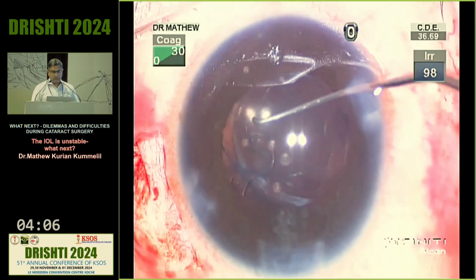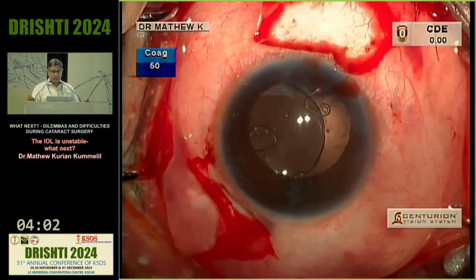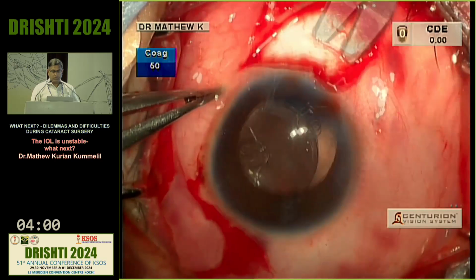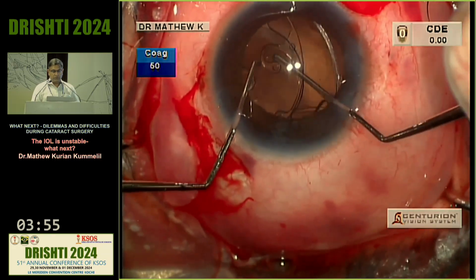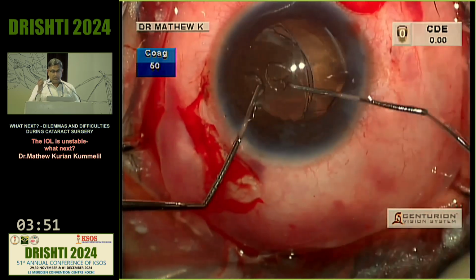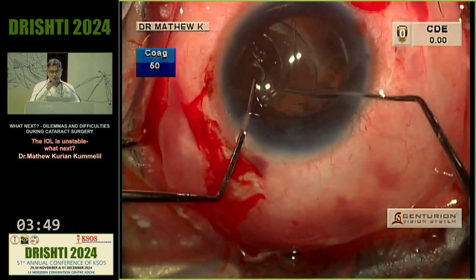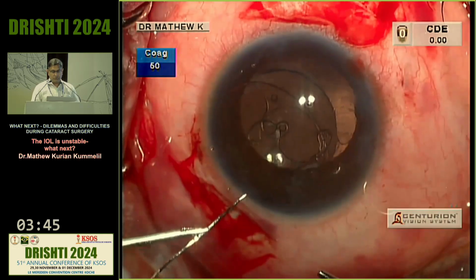sutured. Now what has happened is, in order to give good tension, I have put the knots a little bit too tight and it gives way, and about a year later I had to do further gymnastics with this case. And this time, instead of using Prolene, I decided to use more robust suture.